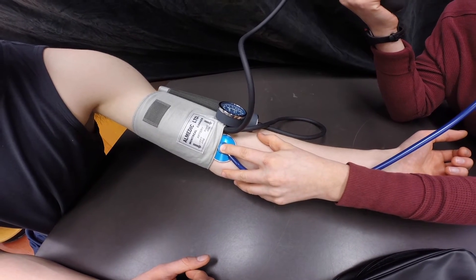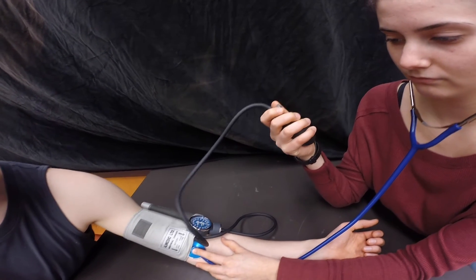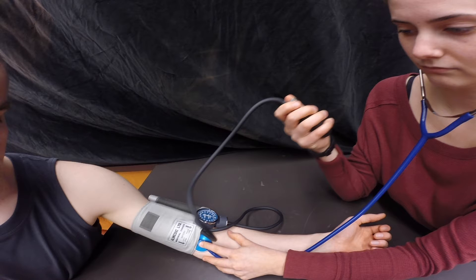Let's do a quick review. The cuff is snug on the left arm about 2-3 cm above the elbow. The stethoscope is placed over the brachial artery and the ear pieces are facing forward in her ears. The pressure gauge is clipped on the cuff and the bulb is held properly in the right hand.